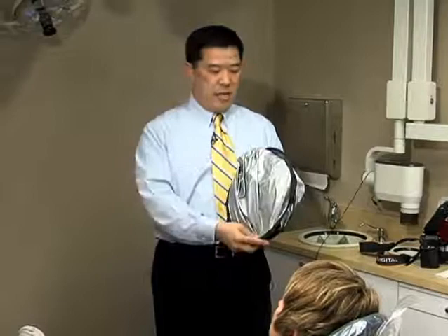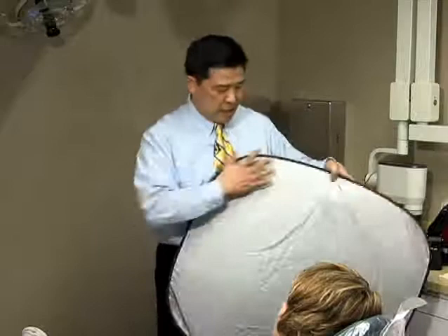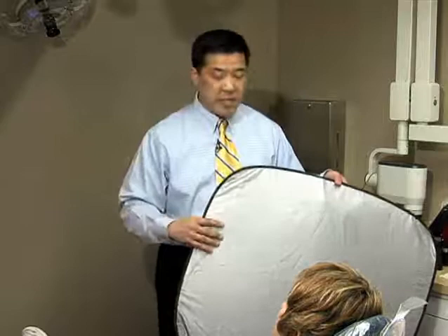What I find really helpful is this — it's just a sunshade for a car. What I like about it is the fact that there are two colored sides on it. I always select one with a black colored side, and it's great for people with blonde hair or light colored hair. And there's usually a colored side — in this case it's silver, but sometimes it comes in a variety of colors like green or blue. It's nice for people with darker colored hair, like myself.